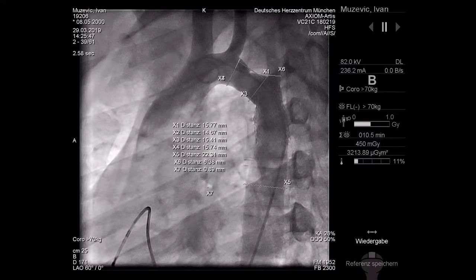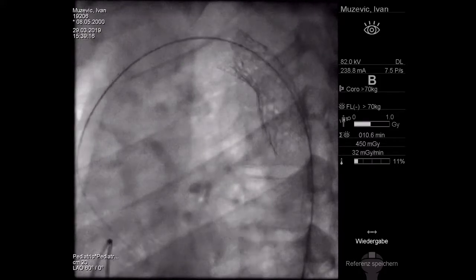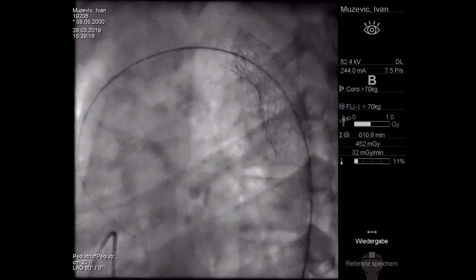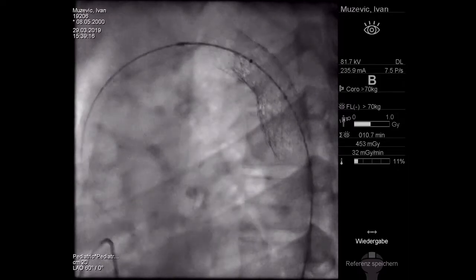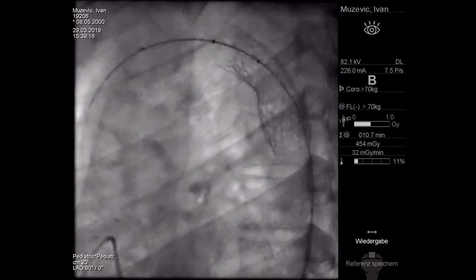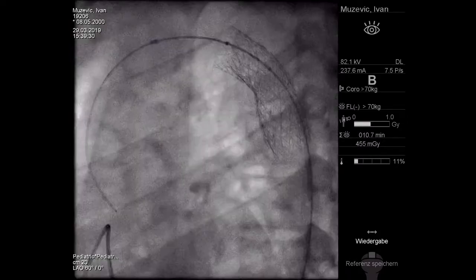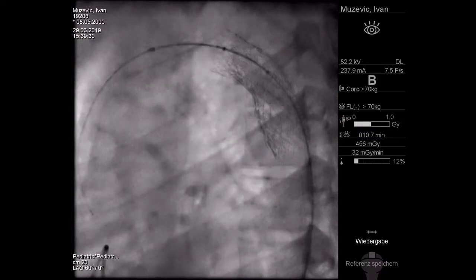So, yeah. Okay. I dilated. I saw it. We do this in a second. You're right. I don't think that it's so decisive, but I know it's good for the eye. And we are now here with the balloon, so it shouldn't be a big deal. You mean here, right? Yes, inferior wall. Okay. So we do it again. Let's go for it.